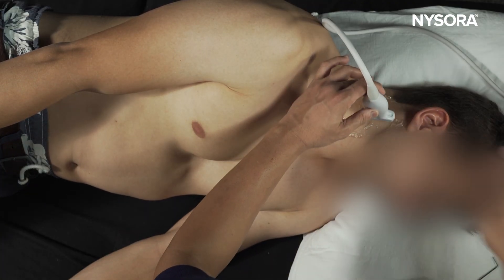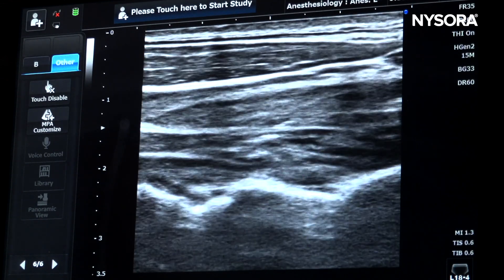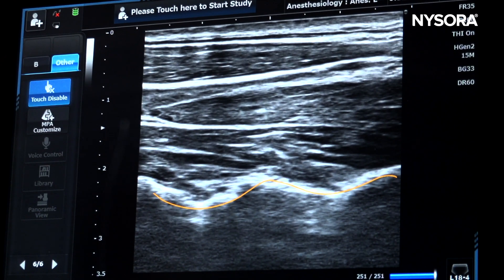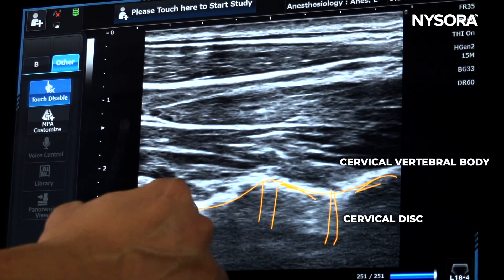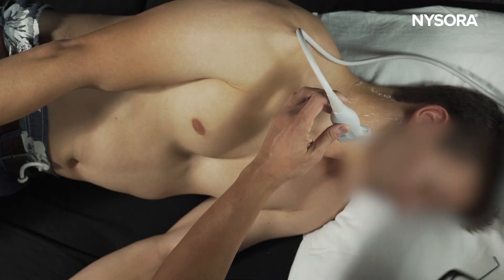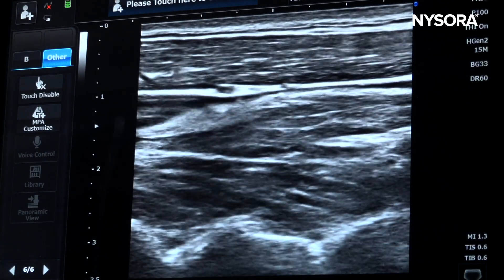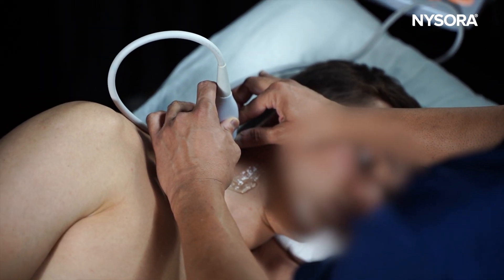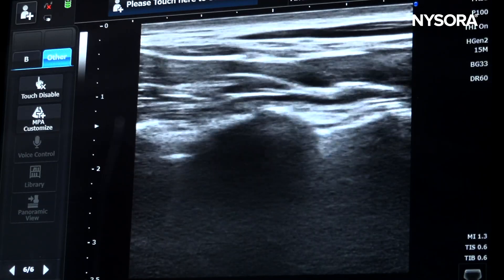I'll also show you what happens when you're scanning too anteriorly. In this image you also see a peak and trough pattern, but this is not where you want to put the needle because you're way too anterior — this is actually the cervical disc along with the cervical vertebral body. I always recommend starting anteriorly with that cervical disc picture, then moving posteriorly to identify the cervical transverse process, and continuing posteriorly to reach the cervical facet joint column and articular pillar, where you will see the correct peak and trough structures.